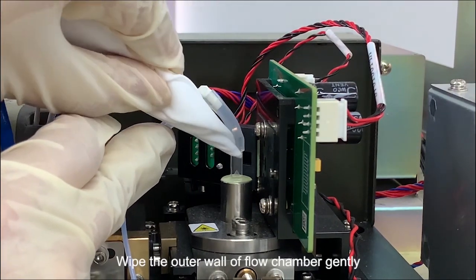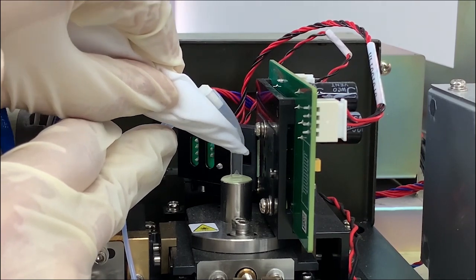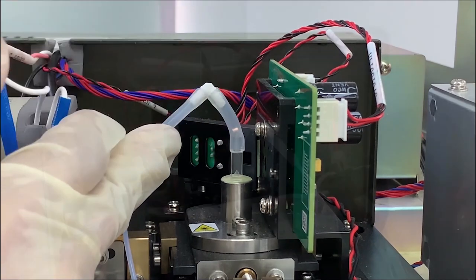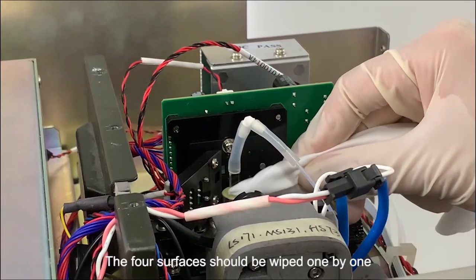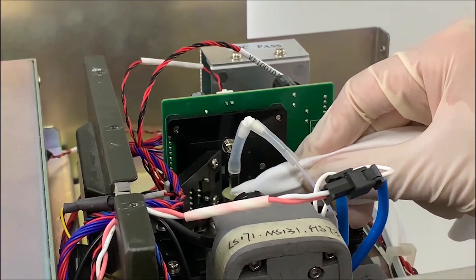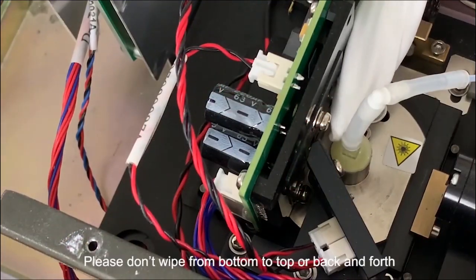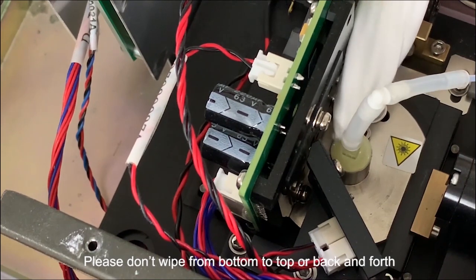Wipe the outer wall of the flow chamber gently. The four surfaces of the flow chamber should be wiped one by one. Wiping order must always be from top to bottom. Please don't wipe from bottom to top or back and forth.